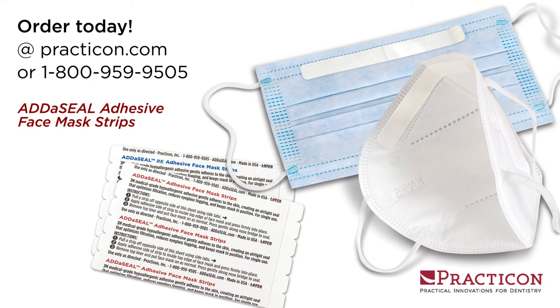When done, Add-A-Seal is discarded along with disposable masks or removed and replaced on reusable masks. That's Add-A-Seal Adhesive Face Mask Strips, another practical innovation from Practicon.